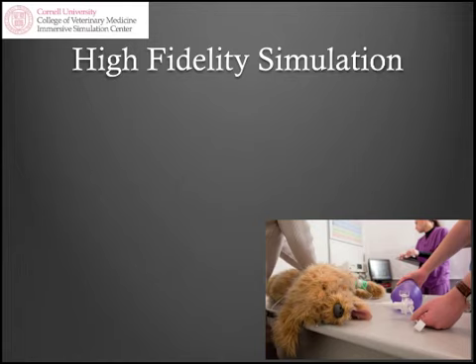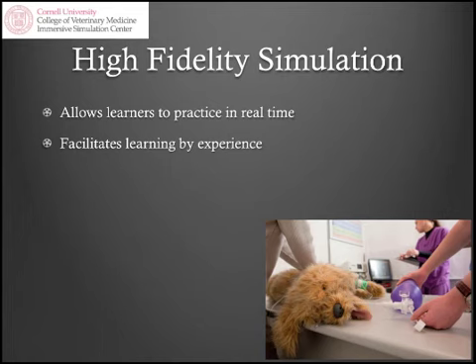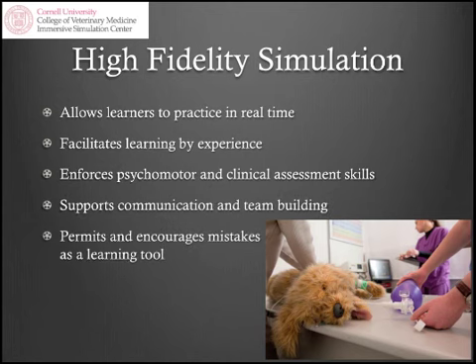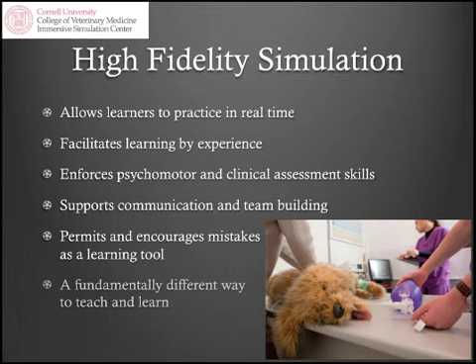In summary, high-fidelity simulation allows learners to practice in real time, facilitates learning through experience, enforces psychomotor and clinical assessment skills, supports communication and team building, permits and encourages mistakes as a learning tool, and is a fundamentally different way to teach and learn.